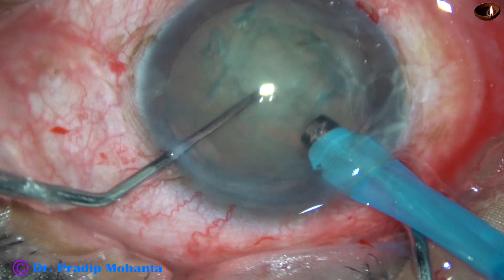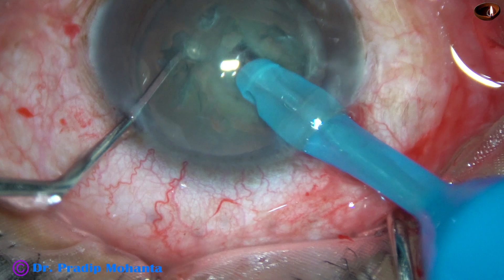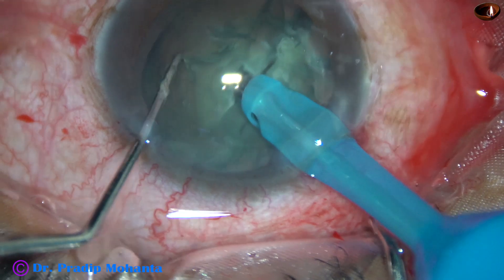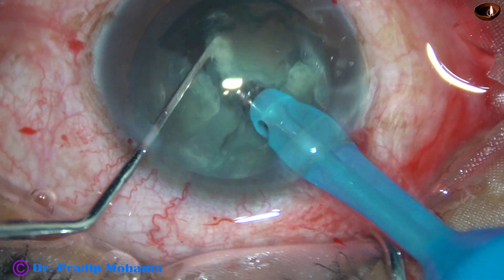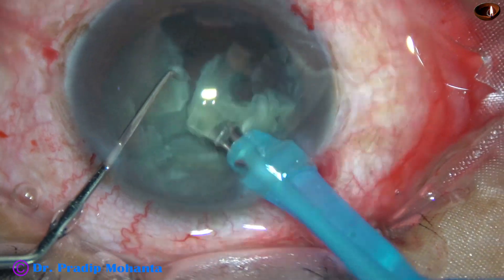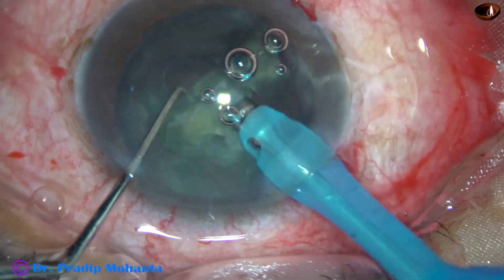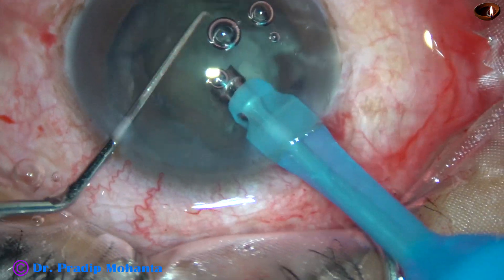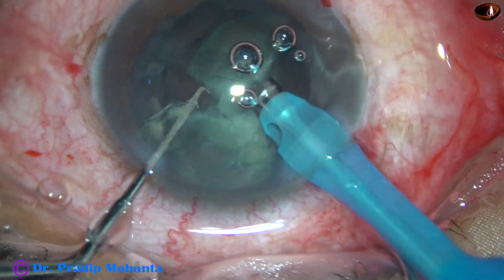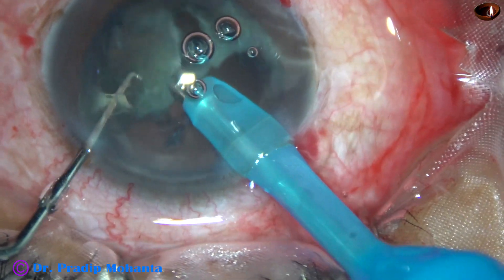Now I am going to do direct chop. The tip is buried into the substance of the nucleus. When the cataract is of this consistency — about grade 3 nuclear sclerosis — the nucleus is held almost at the center. If we go beyond the center, there is a possibility of eating off the lens matter and touching the posterior capsule. So in such cases, we should hold at the central part.